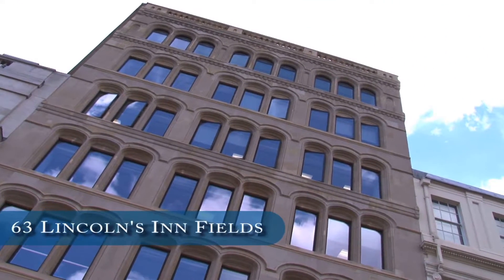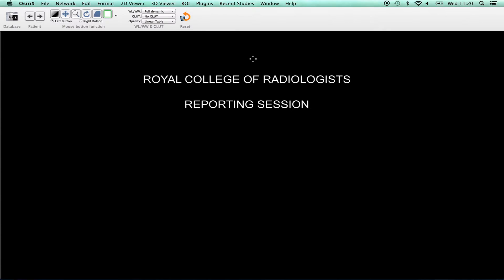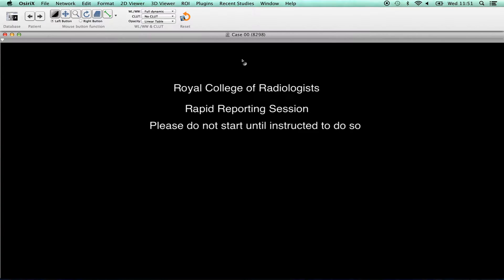Welcome to the Royal College of Radiologists Final FRCR Part B Reporting and Rapid Reporting Component. This video is designed for candidates to demonstrate how to select, view, manipulate and move through examination cases, although it may also be useful for trainers. The two different elements of the exam are run back to back and this instructional video includes guidance on both.